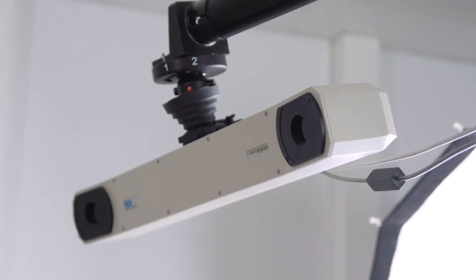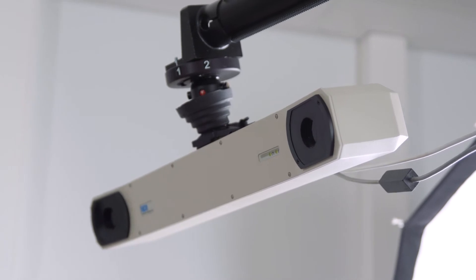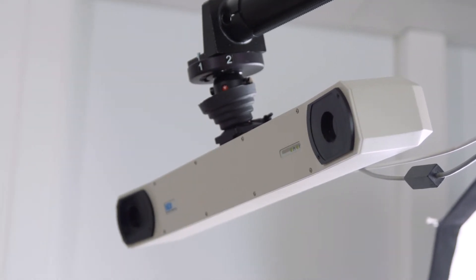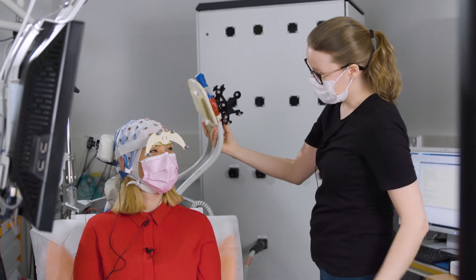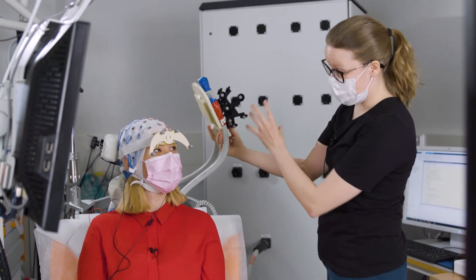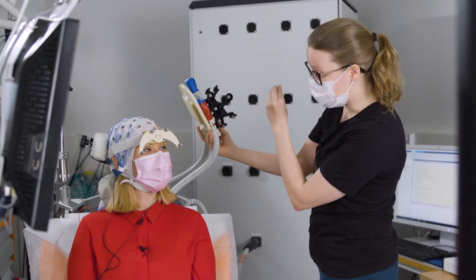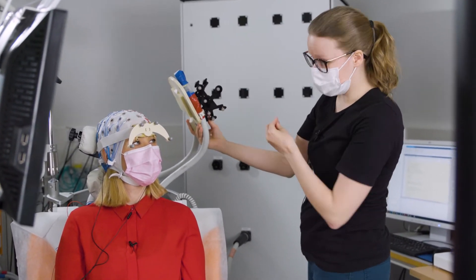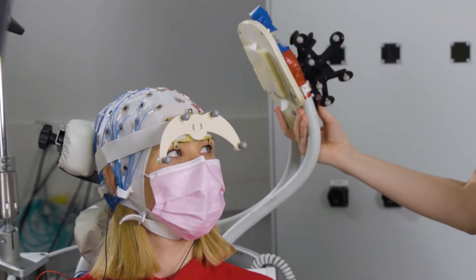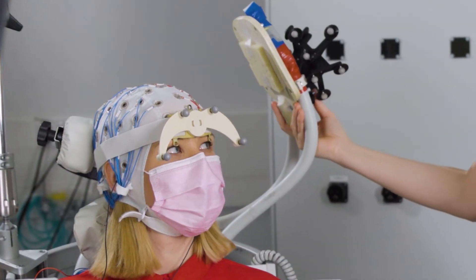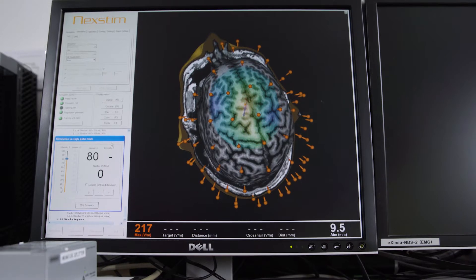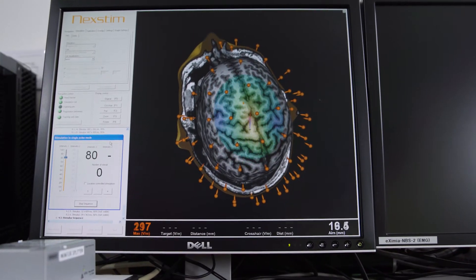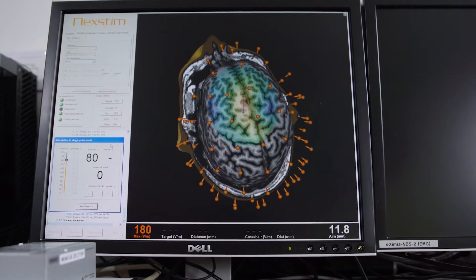Here in front of us we have a camera system that follows your head movements and also this stimulation coil. It has similar markers that the camera can see, so we can follow in real time where we stimulate with respect to the anatomical brain image.